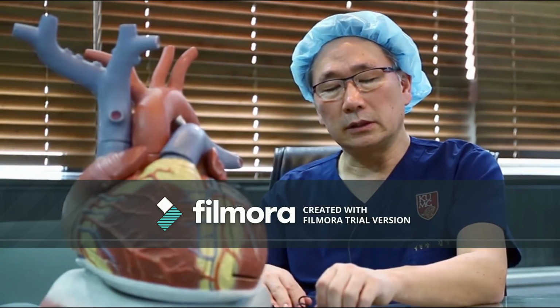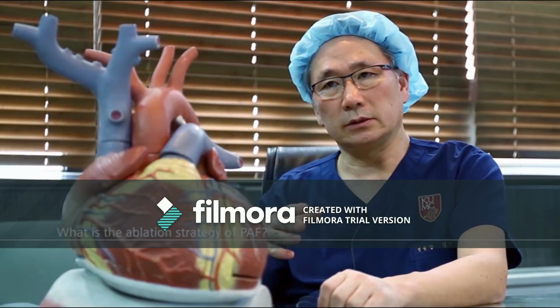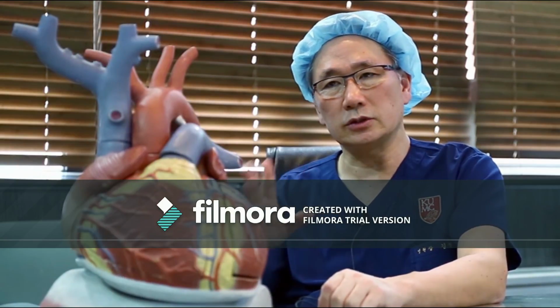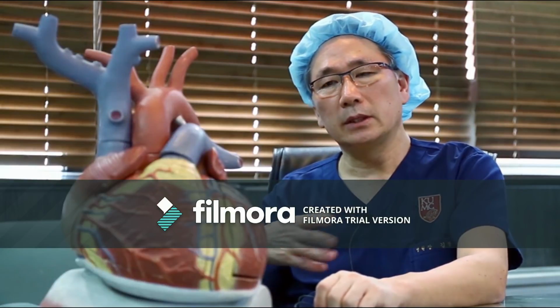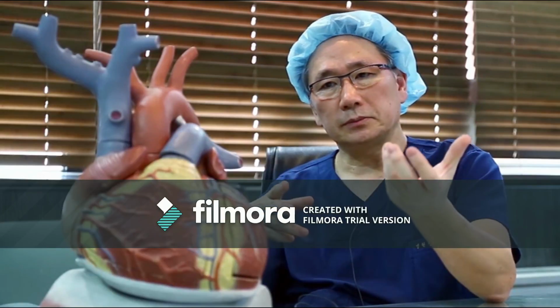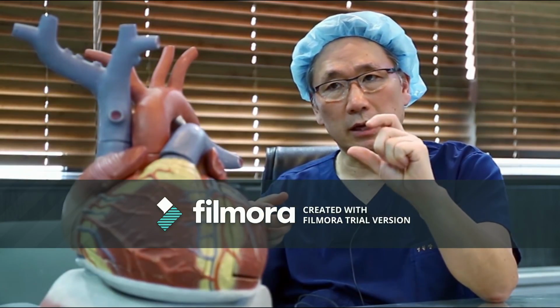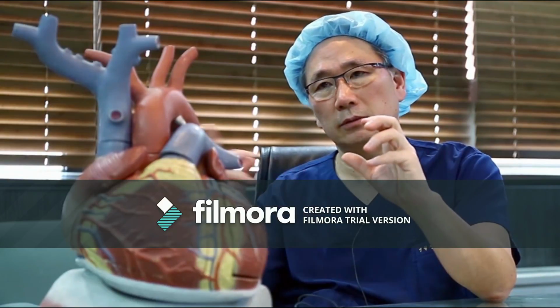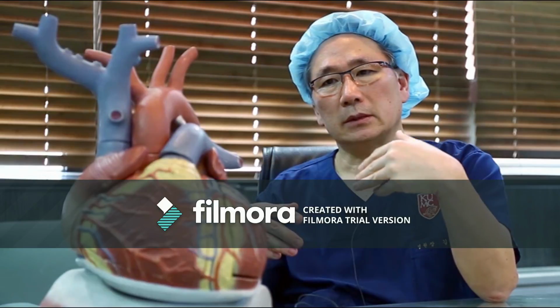So in patients with paroxysmal AF, pulmonary vein isolation is the essential part. For the pulmonary vein isolation in our lab, initially, after we put the multi-electrode, the ring-type multi-electrode, and another one, the ablation bipolar, and then the isoproterenol.